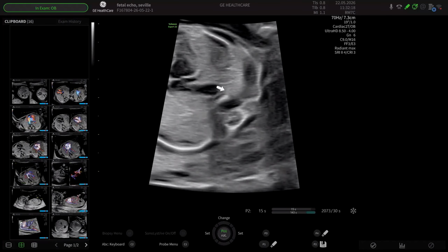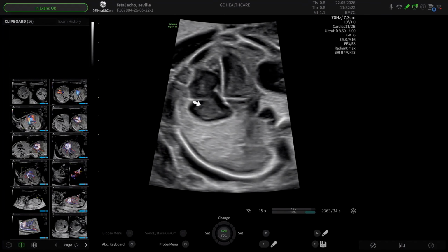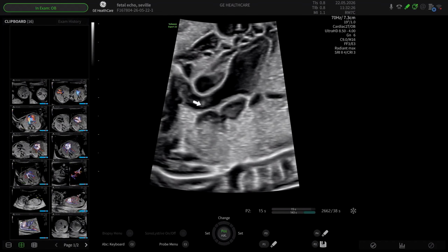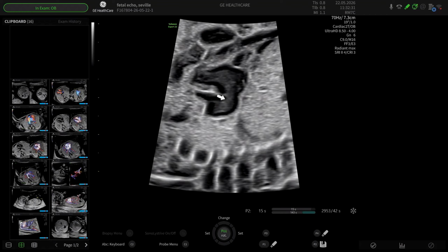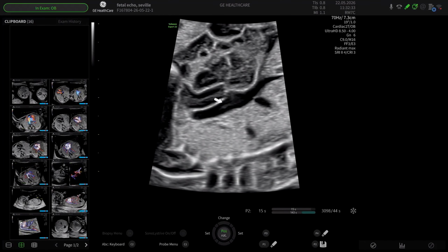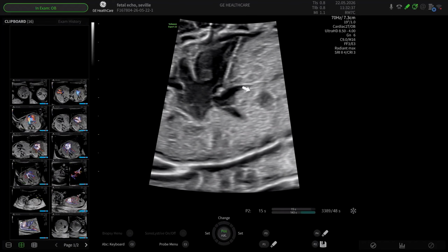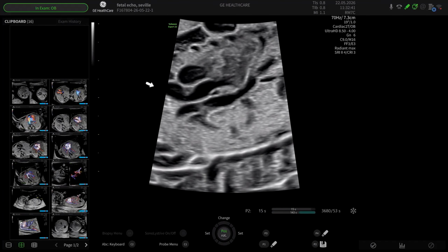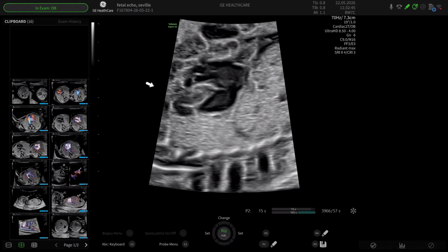I'm going to rotate the transducer the opposite way, sorry. Just go back and do that again. So you find the right atrium and you rotate on the right atrium, and that will bring in your SVC and IVC, referred to as the bull's horns. So this is the superior vena cava coming in there. This is your eustachian valve at this point, which channels blood across. And this is your inferior vena cava, referred to as la cabeza de toro. And there you can see them coming in.